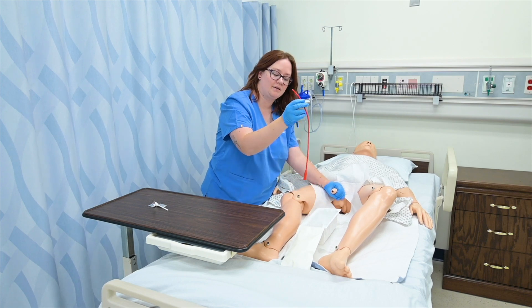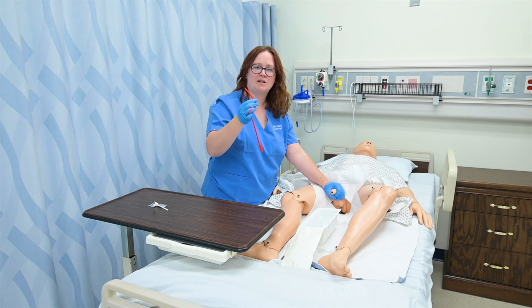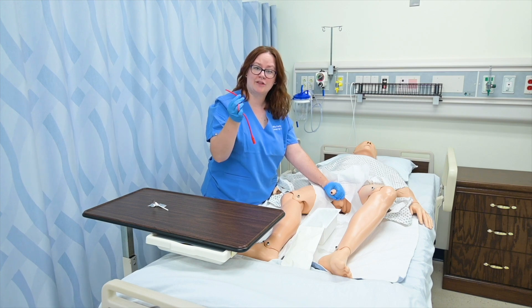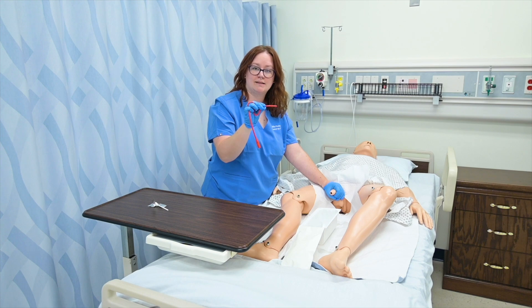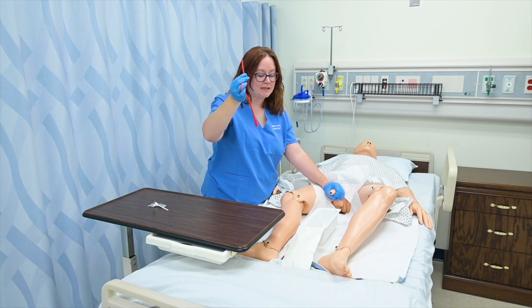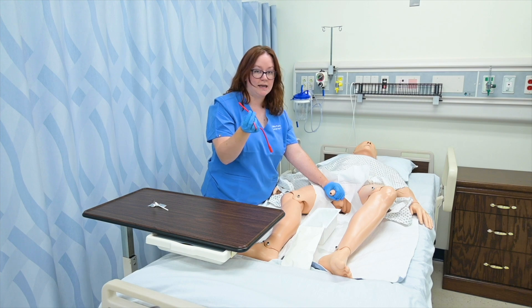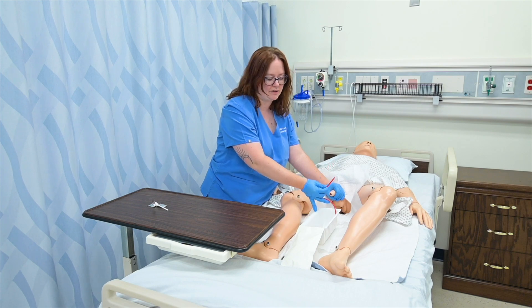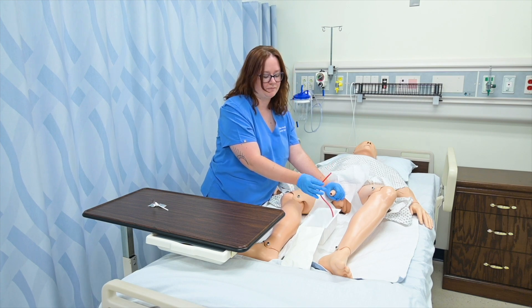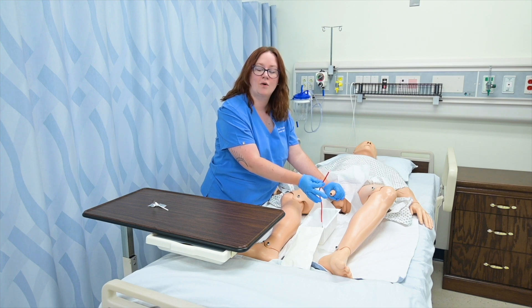I'm going to grab my catheter, being very careful not to let that end hit anything. The difference between an indwelling catheter and our straight catheter is that the straight catheter doesn't have a bag attached to the end — this is an open system. So once this tip goes into the penis and accesses urine, urine will start exiting the end of the catheter. We need to make sure the end of the catheter is in a container appropriate to collect urine. The container in the straight catheterization kit is hard plastic and made for that purpose, or alternatively I could use a urinal or the sterile specimen cup to collect a urine sample.